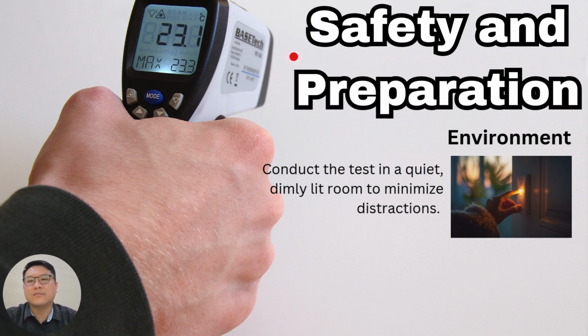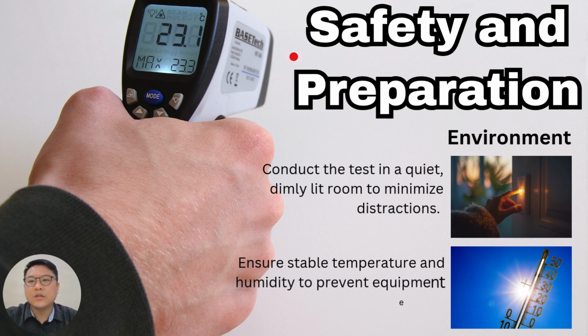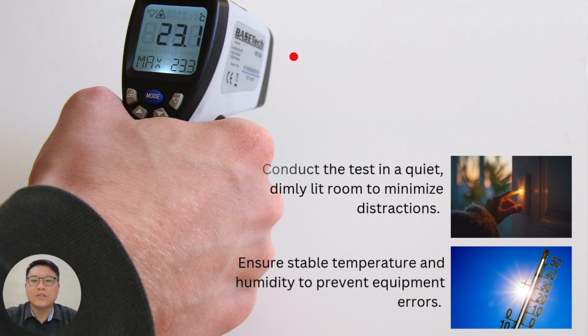and reduce distraction. A calm environment ensures that the patient can concentrate fully on the test target without being disturbed. It is also very important to maintain a stable temperature and humidity in the room. This not only keeps the patient comfortable but also helps prevent equipment errors or performance issues with the Humphrey Visual Field Analyzer. By controlling the environment, we improve both the patient's comfort and the accuracy of the test results.